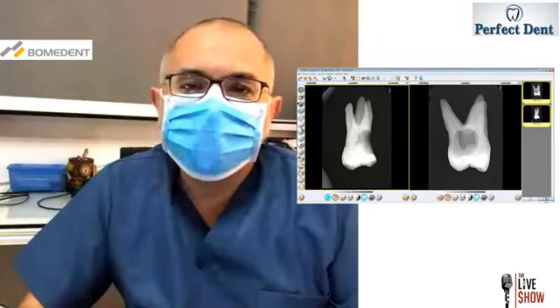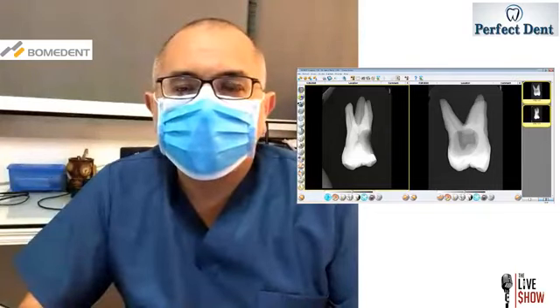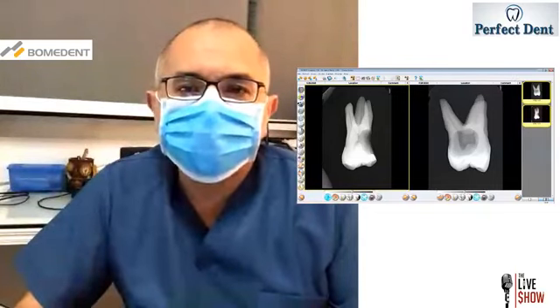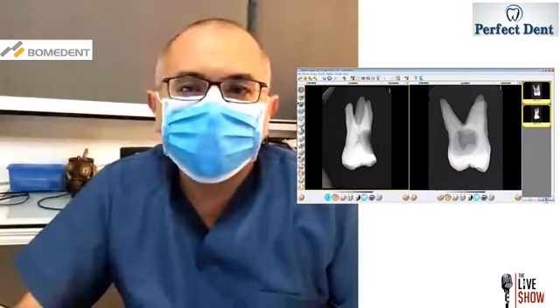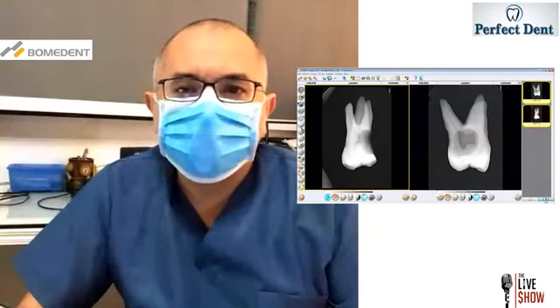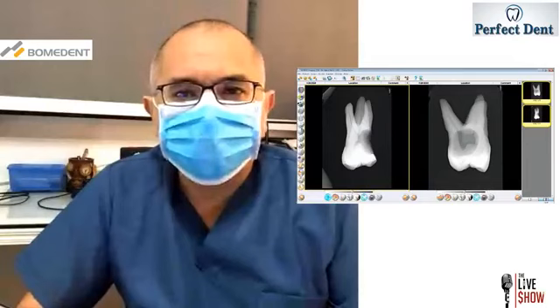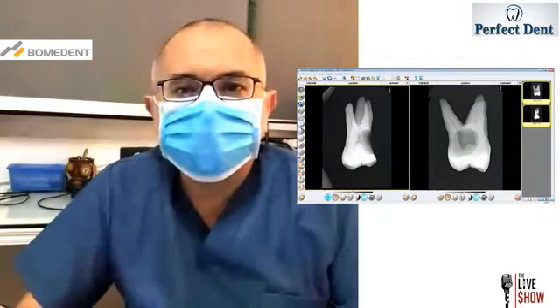They gave me the opportunity to give a live stream of, say, a hands-on in case of a root canal treatment. So as you can see on the screen, right now I'm the one talking to you. In a few moments, I'm going to switch the screen to the tooth that I'm going to be treating. This is designed as a basic root canal treatment from start to finish. I'm just going to be showing you the techniques involved.